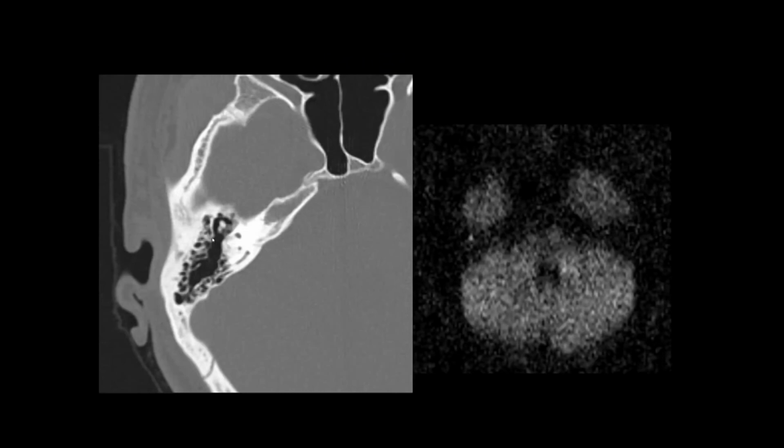This is just a case which was actually a congenital cholesteatoma, but you can see on this CT of the right temporal bone, you can see the ossicles, and there's just this little bit of soft tissue just medial to the malleus head. And this is hard for our neurotologists to see on their otoscopic exam, as you can imagine. And so we just did a non-EPI DWI sequence, and you can see even a lesion this small clearly shows reduced diffusion, confirming that this was a congenital cholesteatoma.